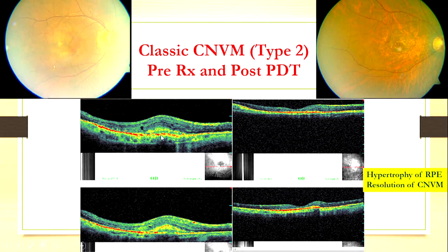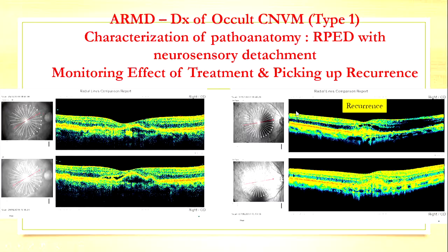Now let's see the follow-up. What happened? This patient was treated by PDT. See what happened — the entire lesion vanished. So you know your lesion has responded very well to your treatment. The OCT will tell you how your patient is responding. But there is a little bit of hypertrophy left as a consequence.